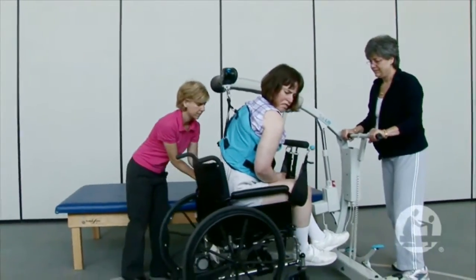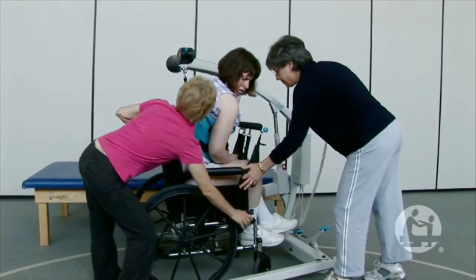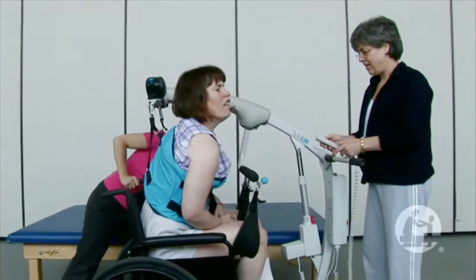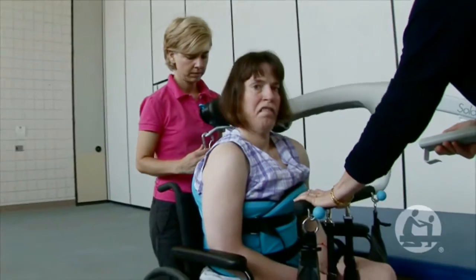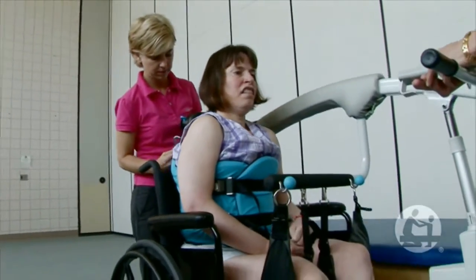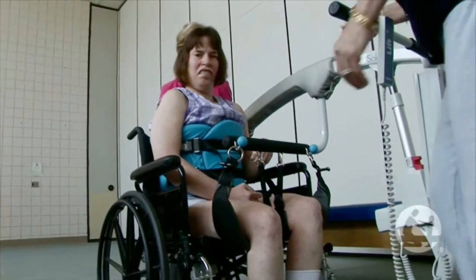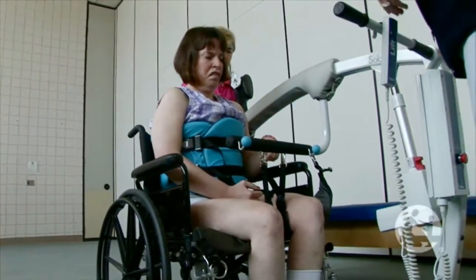It seems that it's a lower profile lift — the vest is lower profile. The leg straps are much easier to use. And being able to push on the bar if the consumer is holding on as you transfer them is another mechanism you can use to get the pelvis fully back into the wheelchair. You don't need that secondary little extra lift to get them back — it's just complete. They're in there.